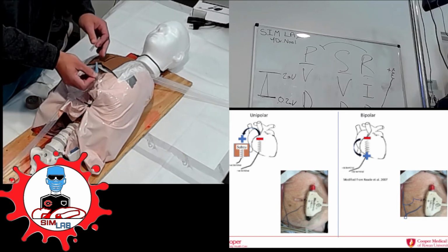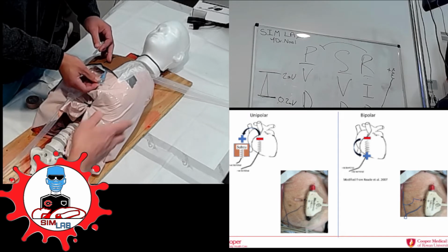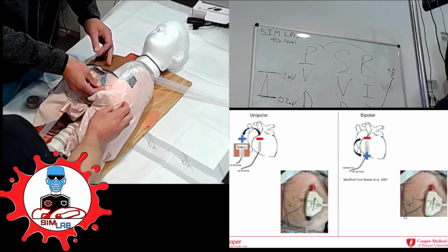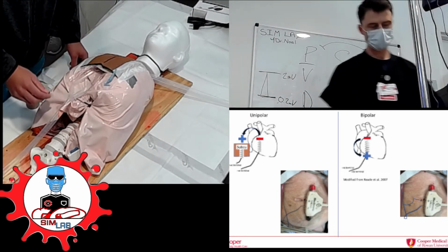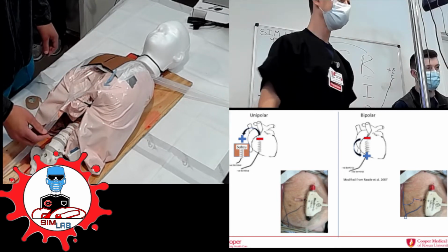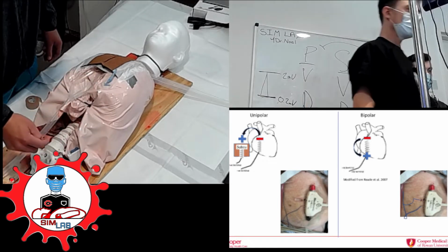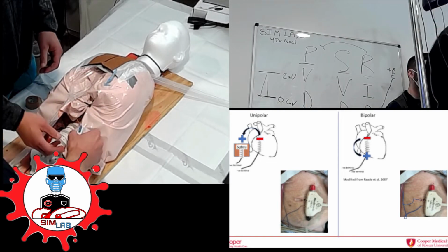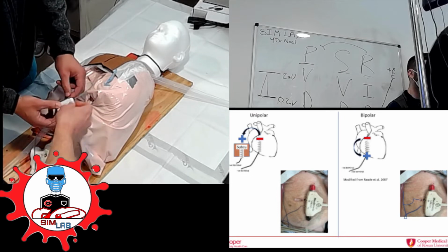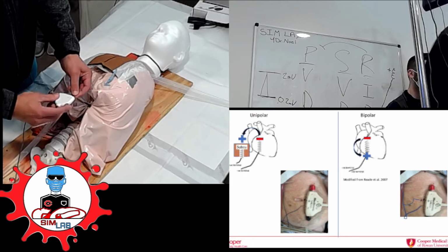Get in and out, get a good chunk of skin. A big chunk is really important. You guys can come up here, don't be shy. So we connect one of the wires to the needle. It doesn't really matter which one you pick, because we just switched the polarity. So take out one of them.